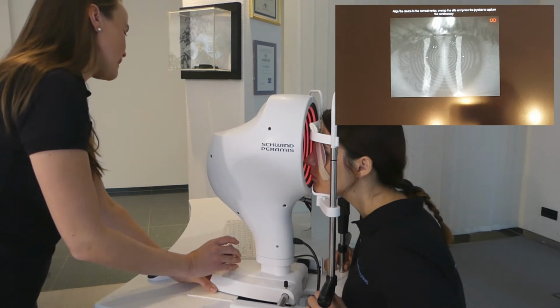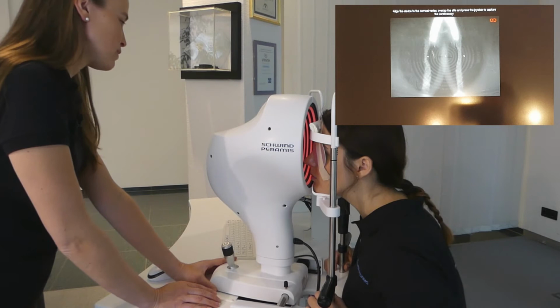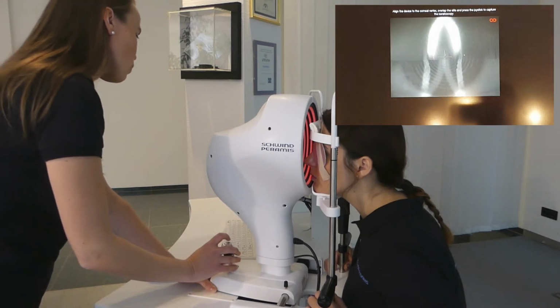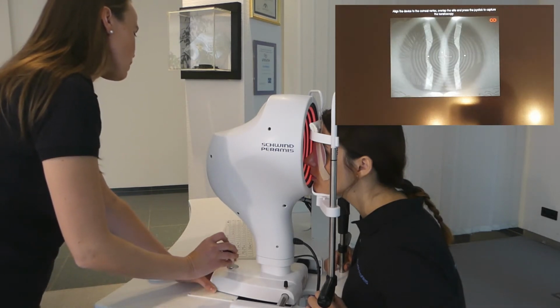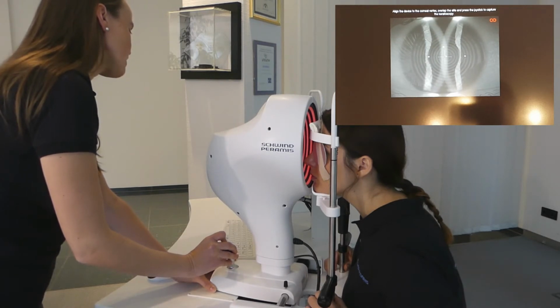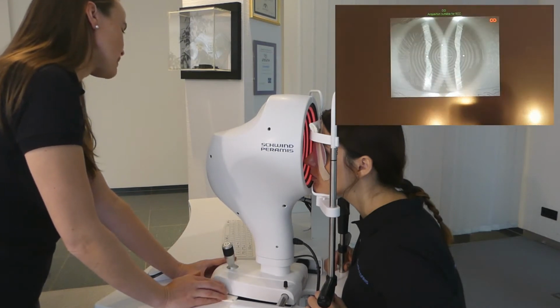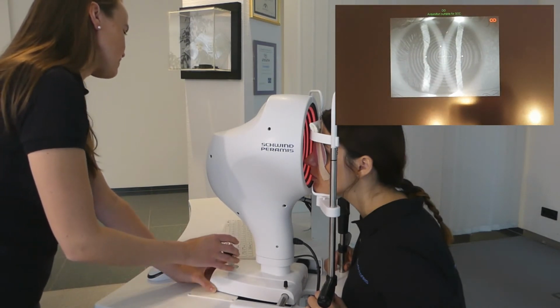Before I acquire my image, I have to let the patient blink. Please, patient, blink, and now open wide. Keep open. When I'm in a perfect centration and perfect focus, I start my measurement by pressing the joystick button.